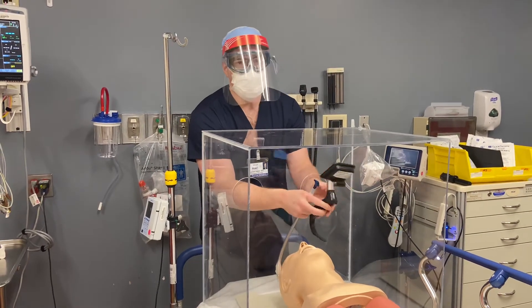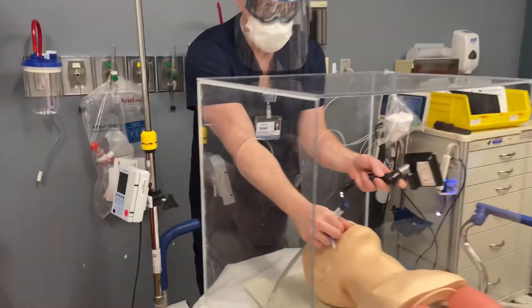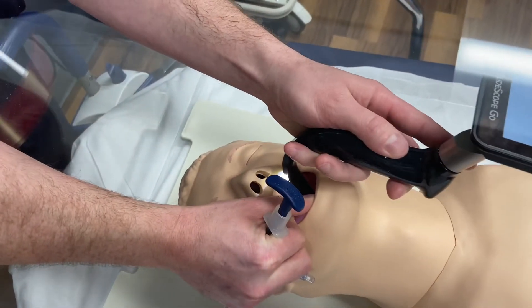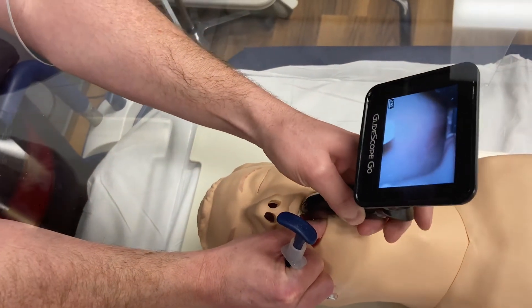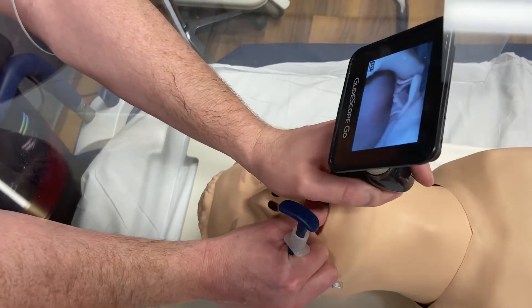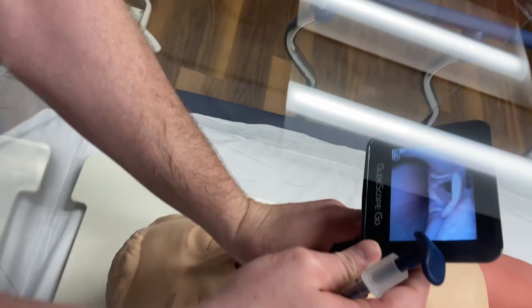Step one: look into the mouth and focus on just putting the GlideScope directly into the mouth. I know this sounds simple, but if you do these steps properly it's a big deal. You look into the mouth and put the scope — the curved part of the blade — into the mouth.